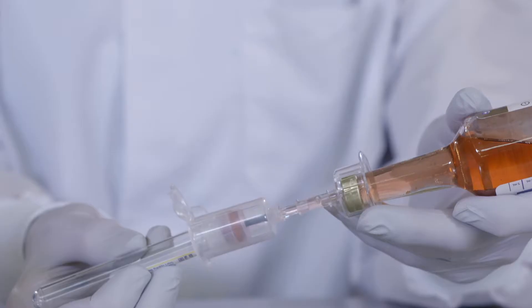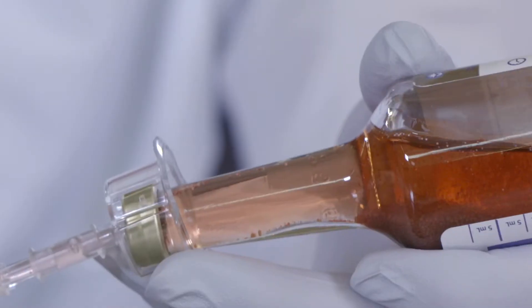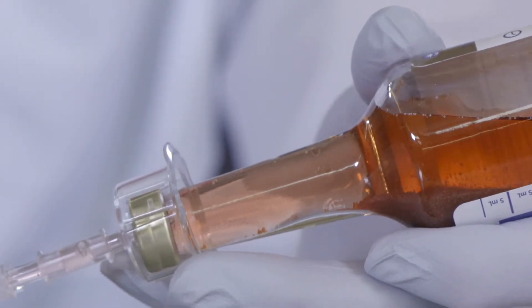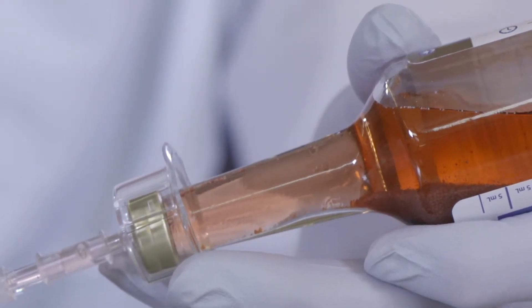If the bottle contains resin beads, angle the bottle so that resin beads gather along the side of the bottle. This helps to prevent resin beads from obstructing the transfer capset piercing tip.